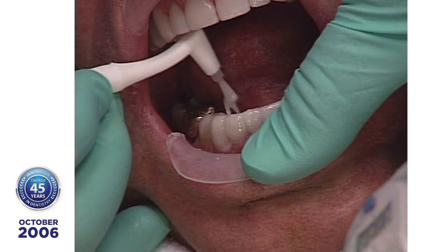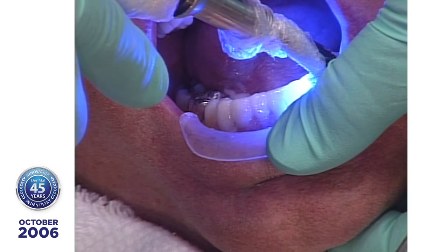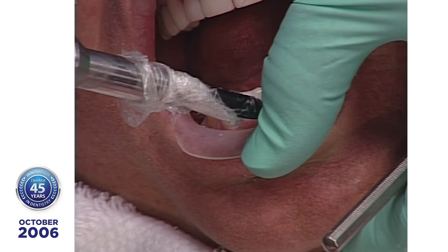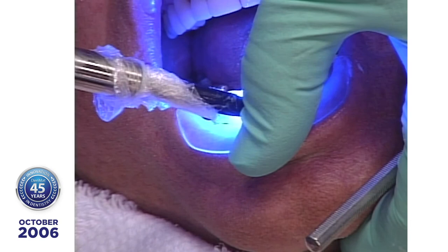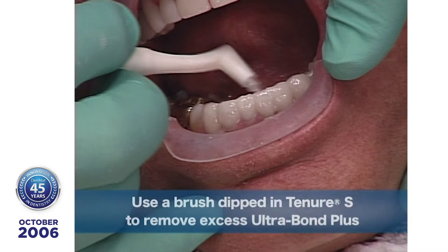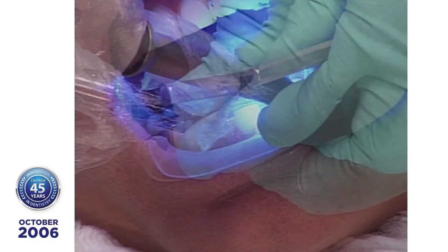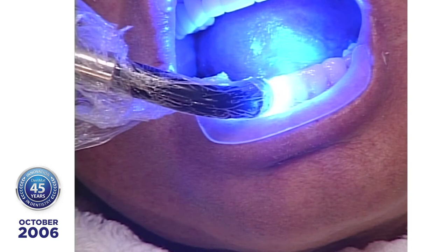All right, now let's see. Close your eyes. Nine millimeter tip for 5 seconds. Close your eyes.